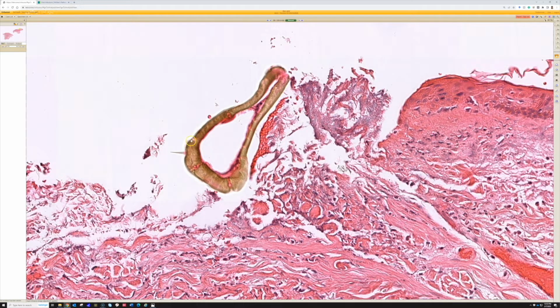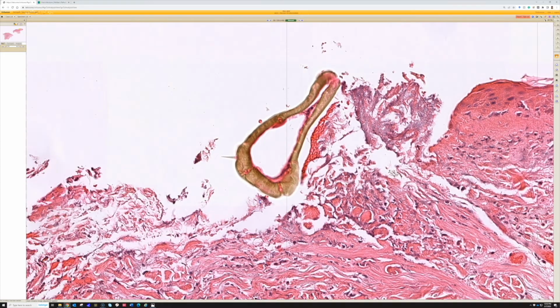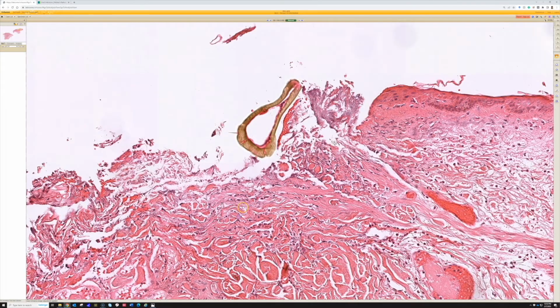But in any case, we have an arthropod here, and you can see a little spine sticking out of it. This is part of the tick mouthpart that was retained and left at the site where the tick bit the patient. Sometimes we will see that persistent retained mouthparts from a tick can cause a persistent tick bite reaction that eventually gets removed by punch biopsy because the patient's had inflammation and discomfort at the site for long after the tick was originally removed from the skin. That's because there's still some mouthparts there, and the immune system is mounting an immune response to those retained mouthparts.